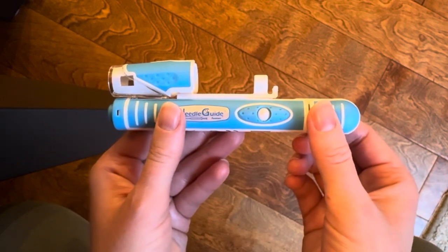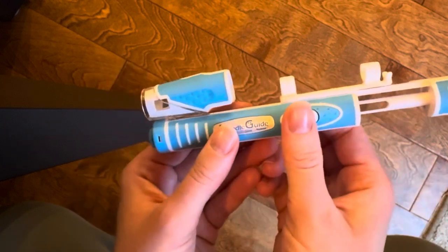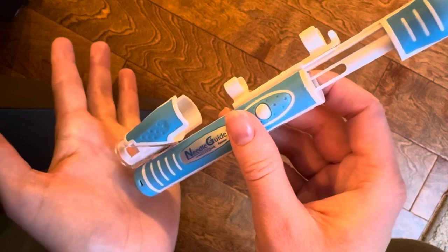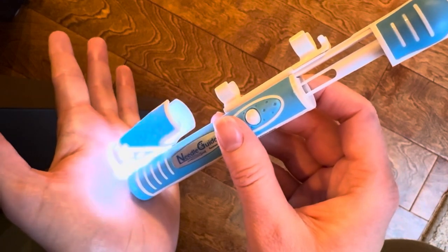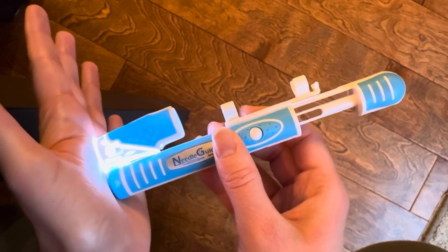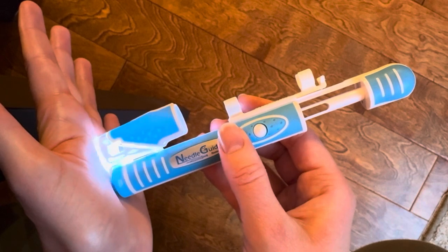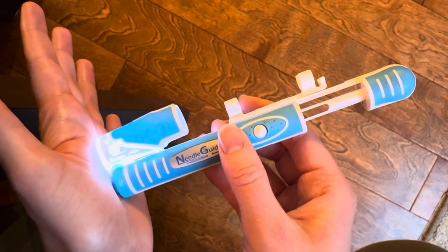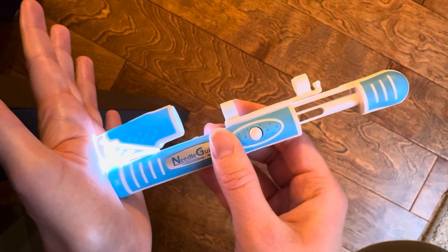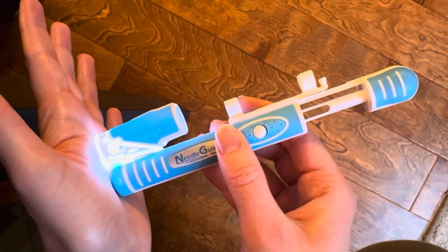A little tip: once you've pulled it back, you're getting ready to inject into your site, you've released the lock, green means good to go. When you place it on your site, you'll see an LED light turn on. This LED light is not meant to stay on continuously — if it stays on, that means you're pressing too hard. It is meant to just flicker. This is a pressure guide, so flickering in and out means you're applying just the right amount of pressure.